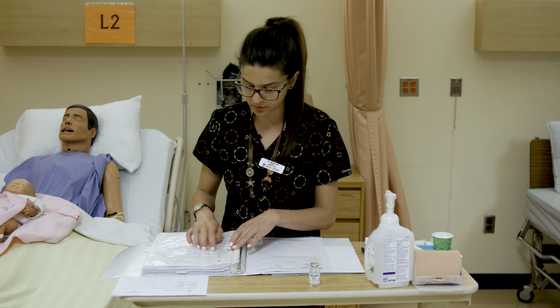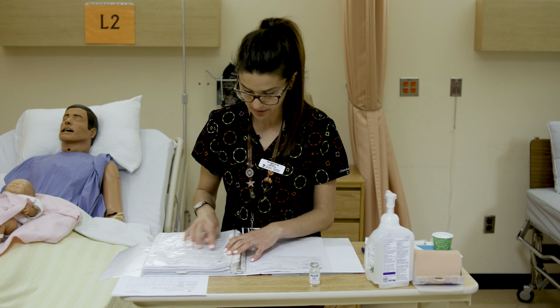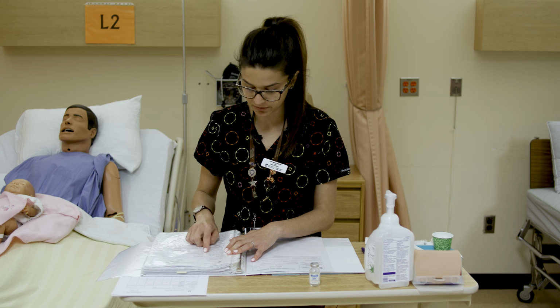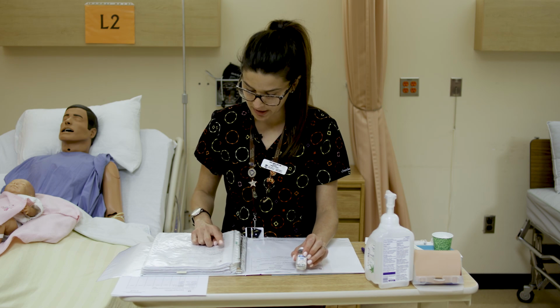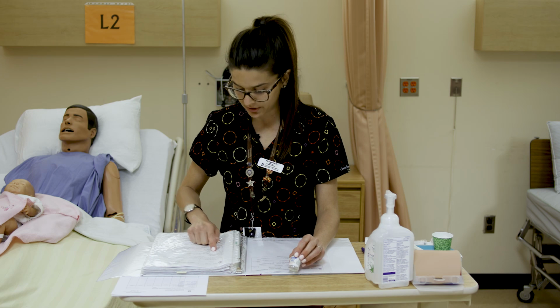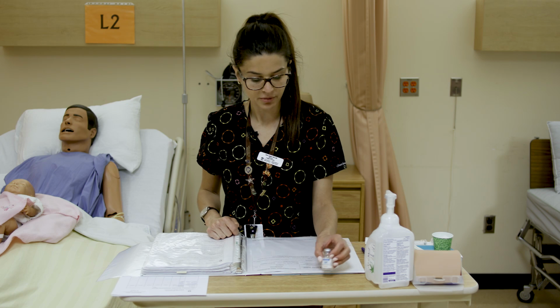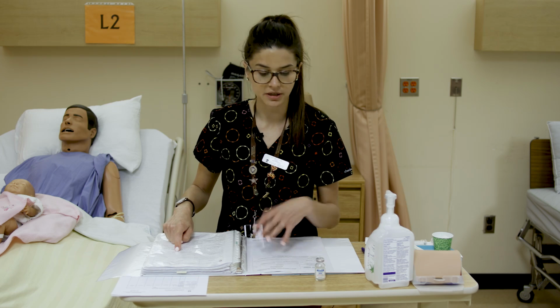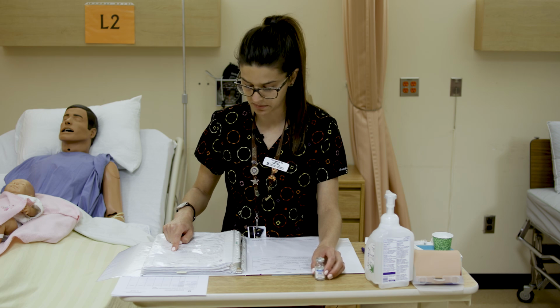But we know that it's an antibiotic. It can be administered by a nurse or student nurse. It's supplied as 500 milligram and 1 gram vials. So we have one of those 1 gram vials. And then it tells you, if you have a 1 gram vial, to add 3.5 mLs sterile water for injection. And that will give you a final concentration once it's diluted of 250 milligrams per mL.